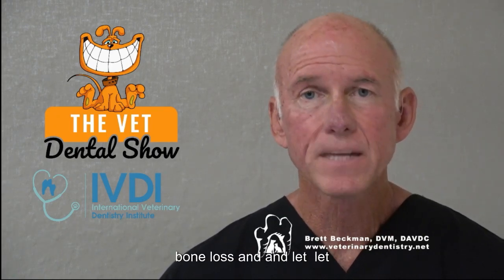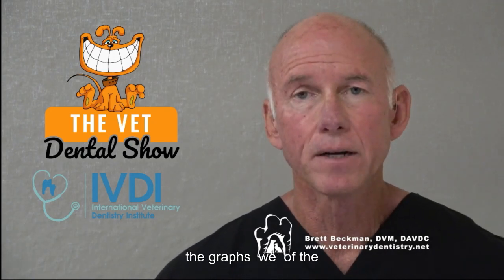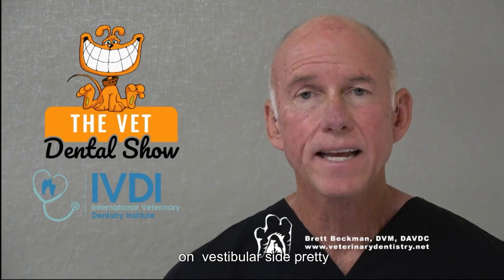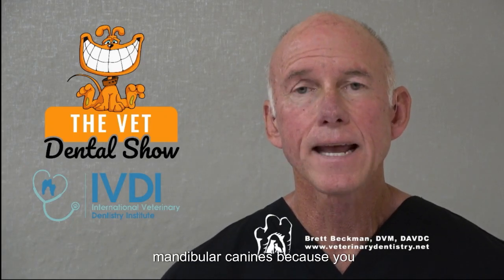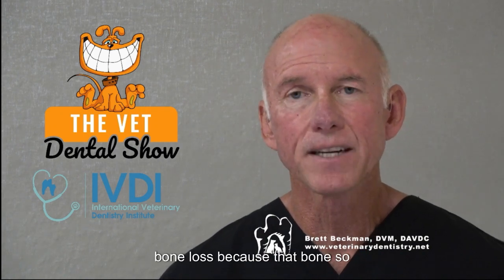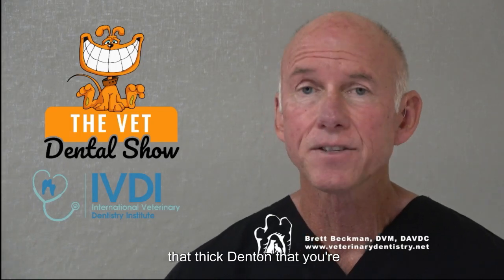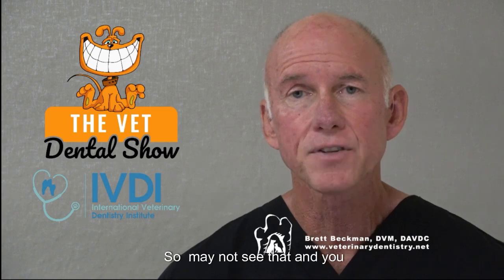And it may be that there is severe bone loss, and let me qualify that with the radiographs that we take of the canines. The canines have super thin bone on the vestibular side, pretty thin bone on the palatal side of the maxilla. Not as much of a problem on evaluating the mandibular canines because that bone usually gets thicker as it goes to the apex. You can usually pick that up. But on the maxillary canines, you may not see the bone loss because that bone's so thin and it's superimposed with your radiograph over that thick dentin that you're taking in addition to that thin bone. So you may not see that.